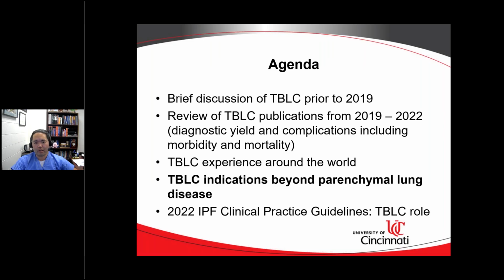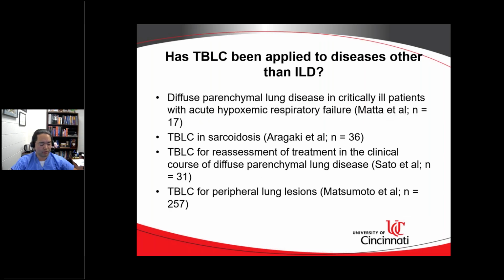There are other things, right? As with everything in life, if you get comfortable with your technique and you are having great results, and the complication rate is small, you venture to do something else. There are certain things that I've found on the web, in PubMed. This is a publication that we were part of. Dr. Benson was here in Cincinnati and went to Einstein. He published a two-institution experience with cryobiopsies in patients with acute hypoxemic respiratory failure and diffuse parenchymal lung disease. I'll give myself a little pat on the back. I'll tell you about our experience in sarcoid here.